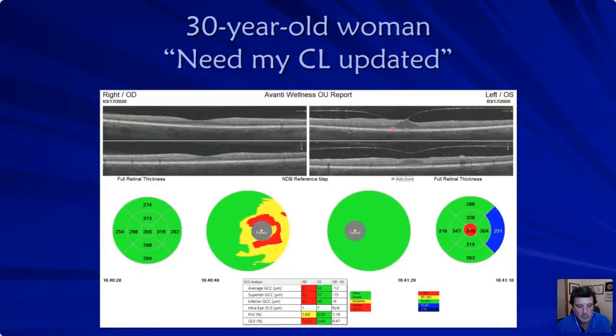That's nothing more than what lights up bright white. So the bright white at the bottom here is the RPE. The next one up is part of the photoreceptor that has the largest amount of mitochondria in it, and they call that the ellipsoid zone of the photoreceptor. Right above that is the myoid zone, which is kind of like your Golgi apparatus and all the different structures that are in there. But since the mitochondria is so tightly packed, that's what we used to call the inner and outer segments.